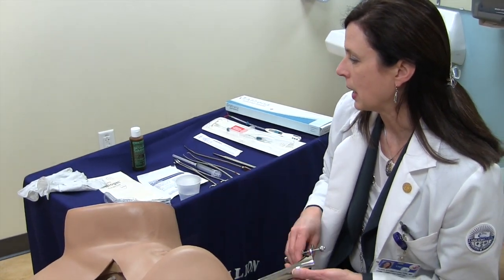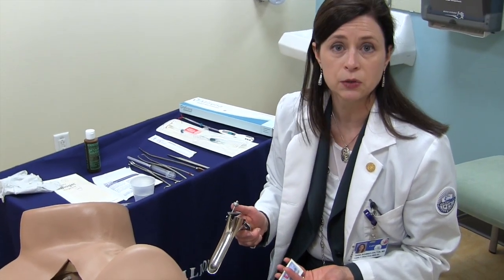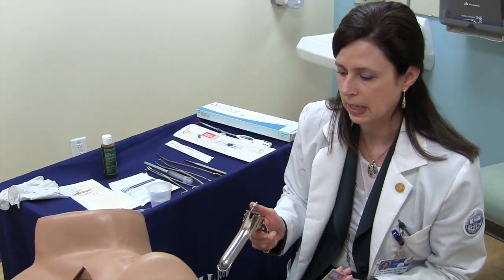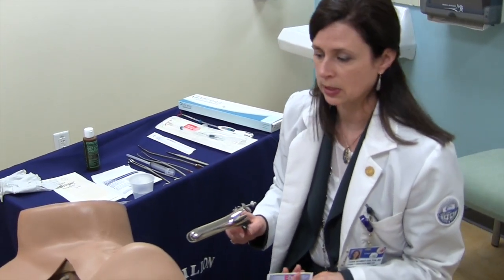You can use either a metal or a plastic speculum. We prefer the metal — it's a little bit easier for insertion and it's nice and stable. Typically a medium size for either a Graves or Peterson is appropriate.